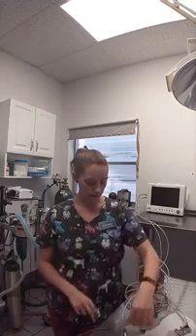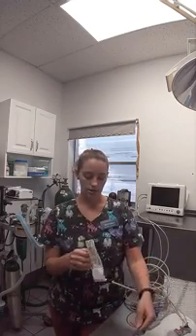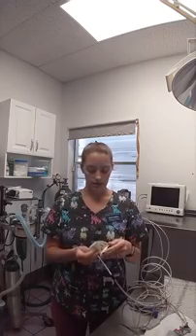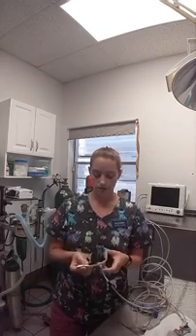Another one of our monitoring devices is our blood pressure cuff. It's measuring the force exerted by the flowing blood through the arterial walls, and it's measuring how well the perfusion of the tissues is. And you want the blood pressure cuff to be 30 to 50% of the circumference of the patient's extremity that you're using. You can use the patient's front leg, back leg, or tail.